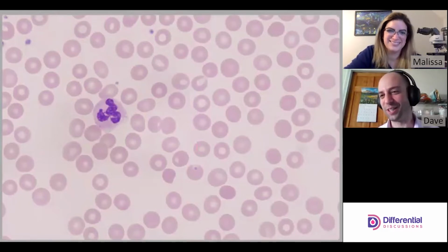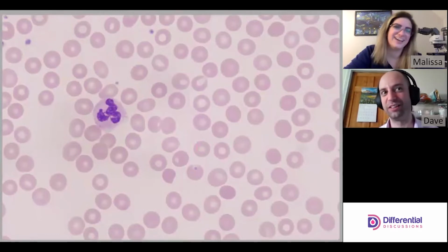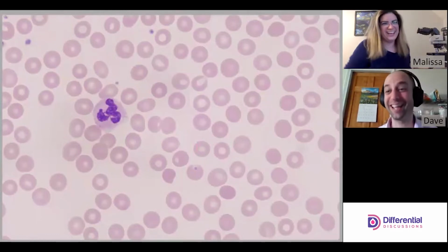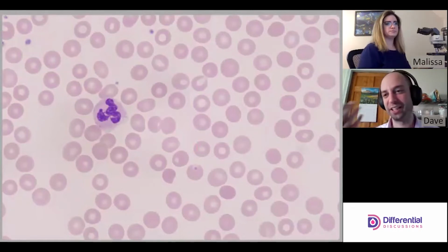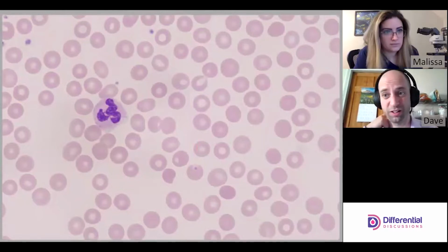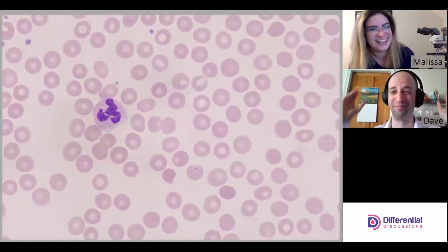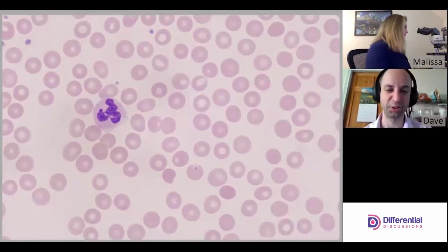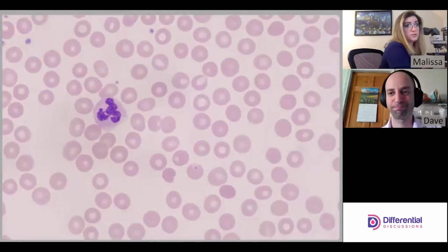It's tough though, because we'll say that and it is obvious to us, but for now it takes time. It does. If we had to say how many smears we've looked at in our career so far, it's innumerable, right? It's just a big number. So yeah, absolutely, experience. If any of you have studied micro, TNTC is too numerous to count.